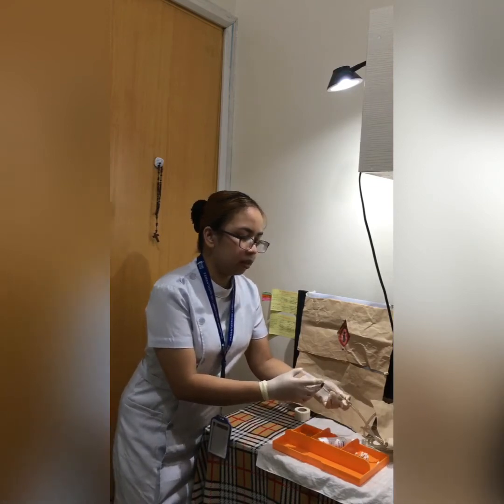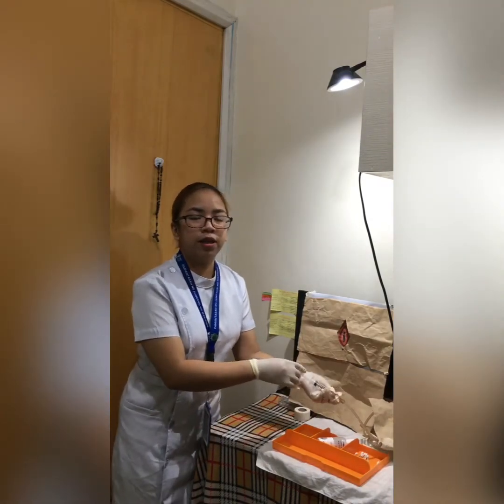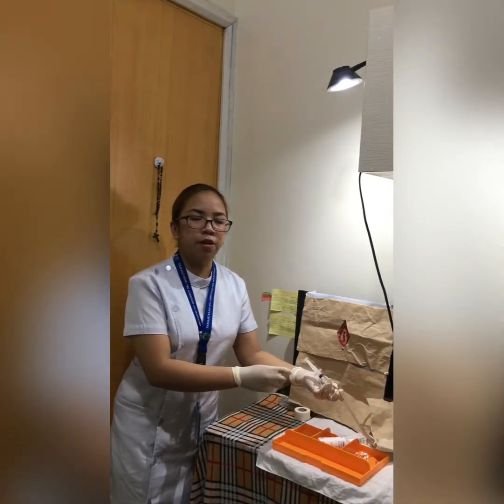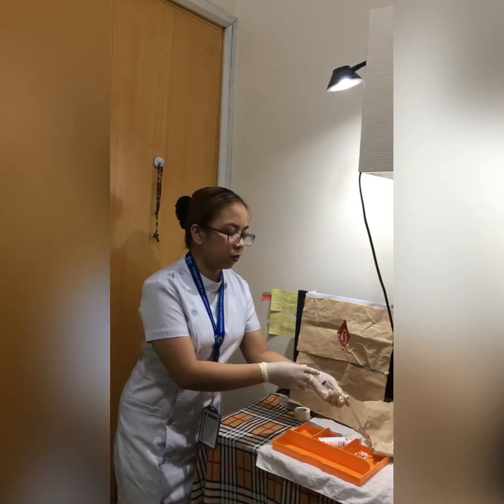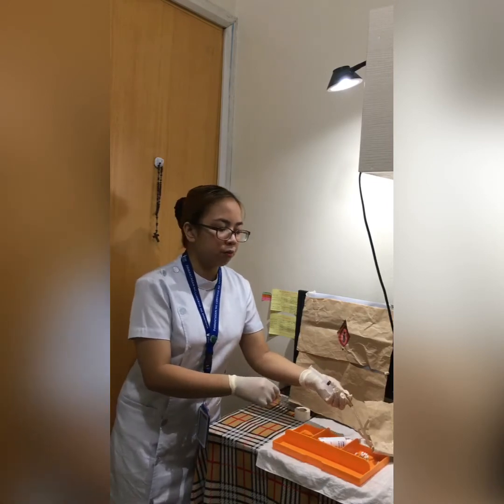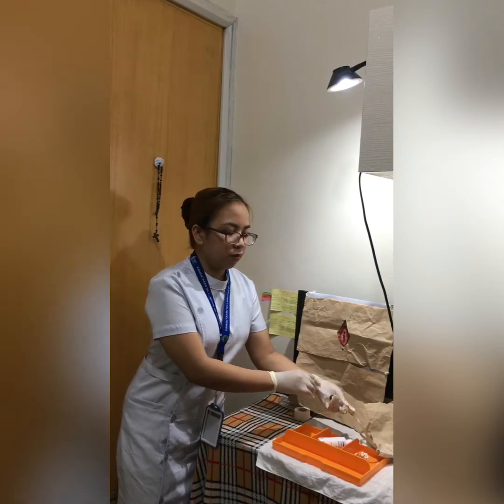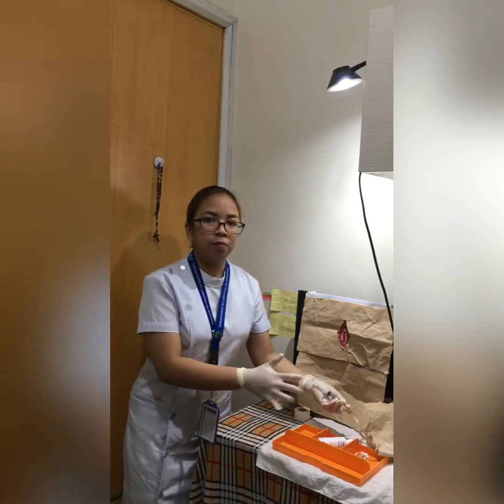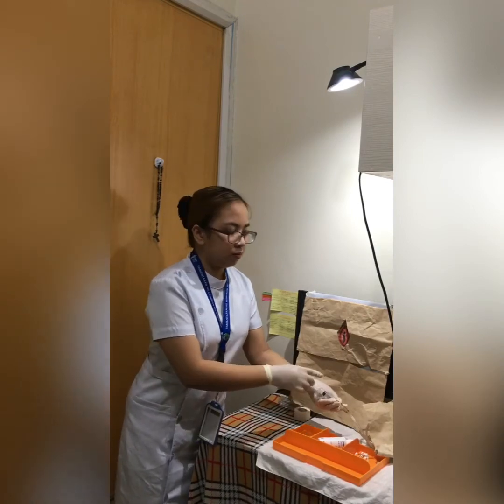I'm going to insert this beforehand. Then what we do sometimes is check the retention balloon to see if it is functioning normally. Sometimes the balloon is malfunctioning, so we have to know that beforehand so that we can avoid difficulty in inserting the catheter.